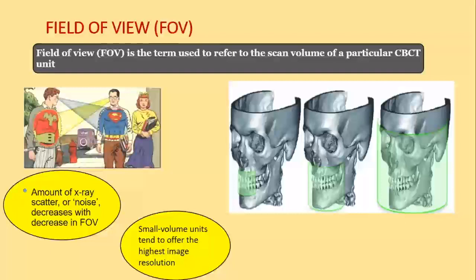So literally, I don't think you should go by the cost, but instead say, I want to look at the upper eight. I want to look at the maxillary sinus. Let the diagnostic center, let the dental school make that choice for you. But for you to understand right now, the smaller the volume, the better the resolution.